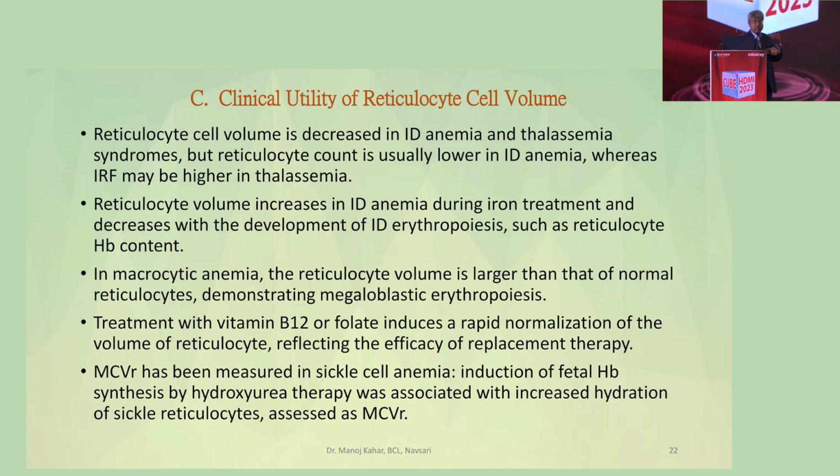So when you are replacing the therapy, all these newer parameters will tell you that your patient is improving earlier than the routine MCV or hemoglobin. They tell you earlier whether a patient is responding or not.